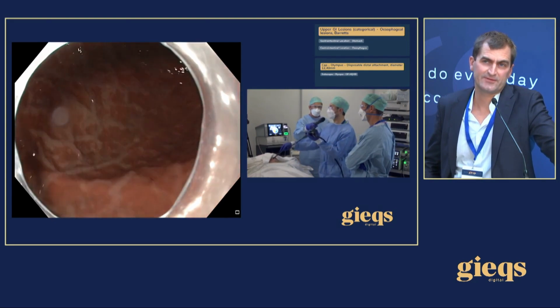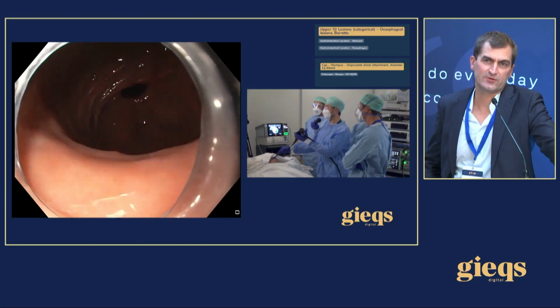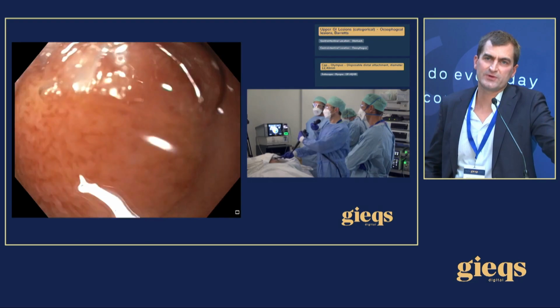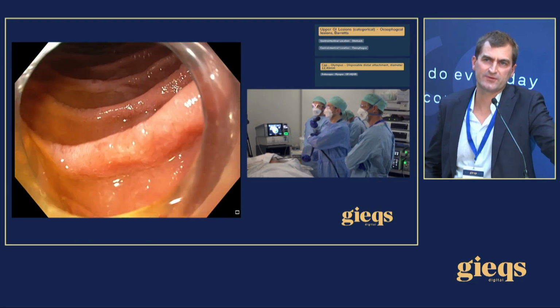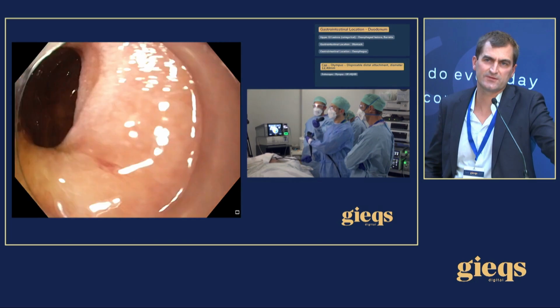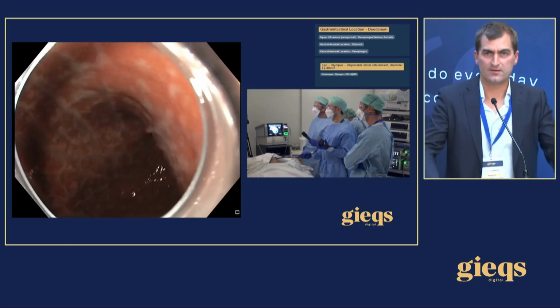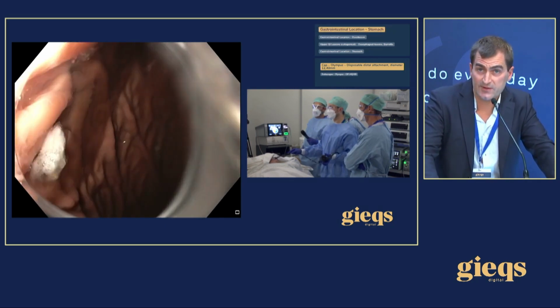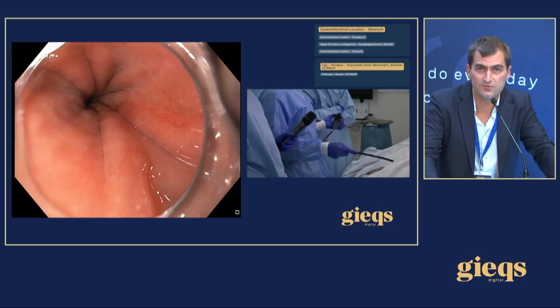Yeah, we know the guidelines, of course, but in my experience, people refer those patients quite quickly, and we have many surprises. We welcome patients in an attempt to perform RFA ablation, and in every case, of course, we rescope this patient for staging with high quality endoscopy, and sometimes we do not find any dysplasia, or sometimes we find an advanced lesion like T2 or T3.